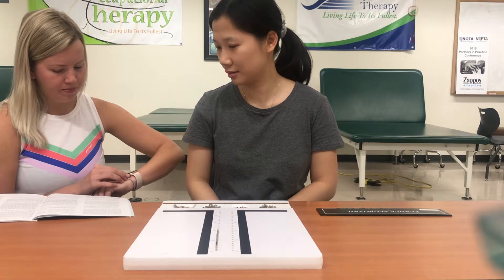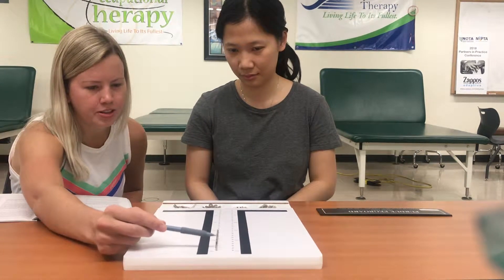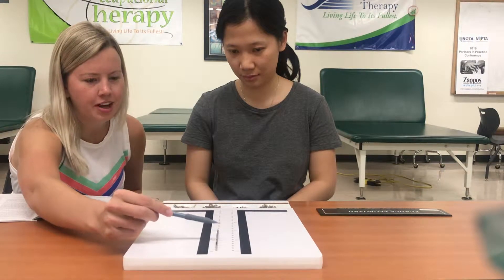Stop. The examiner counts the pins inserted: one, two, three, four, five, six, seven.